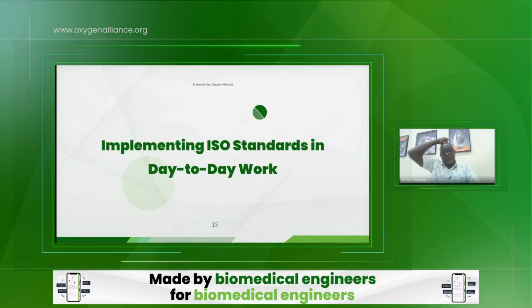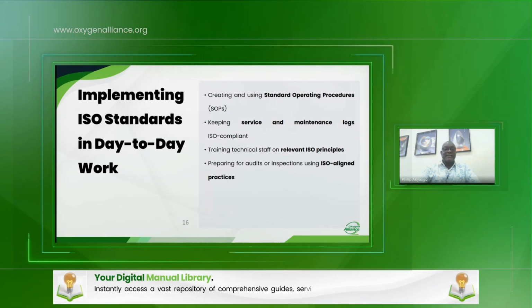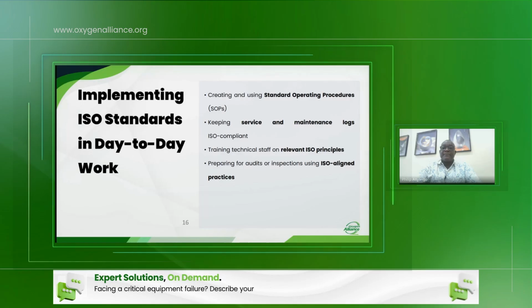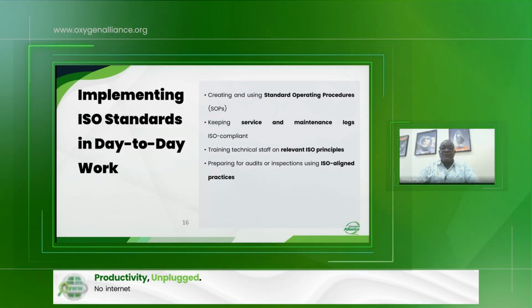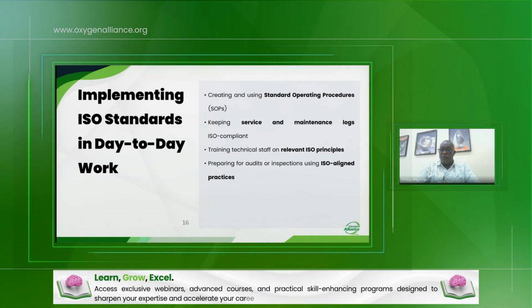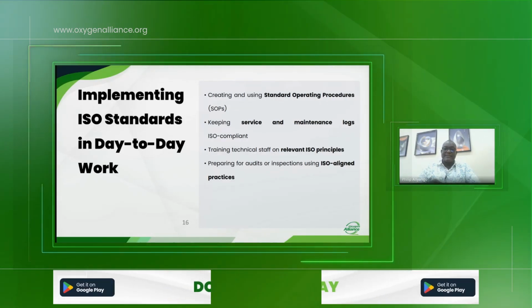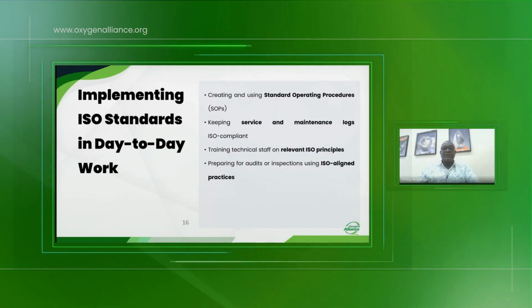Implementing ISO standards in workplaces, I think I've discussed that. Implementing ISO standards in day-to-day work, we're creating and using standard procedures, SOPs, keeping ISO-compliant service and maintenance logs, training technical staff on relevant ISO principles, and preparing for audits and inspection using ISO-aligned practice. That is when we're practicing it in our day-to-day work.